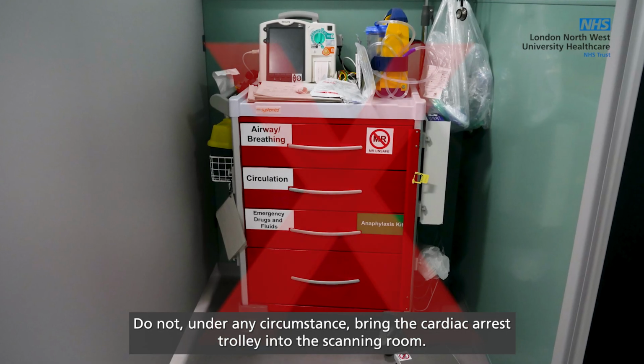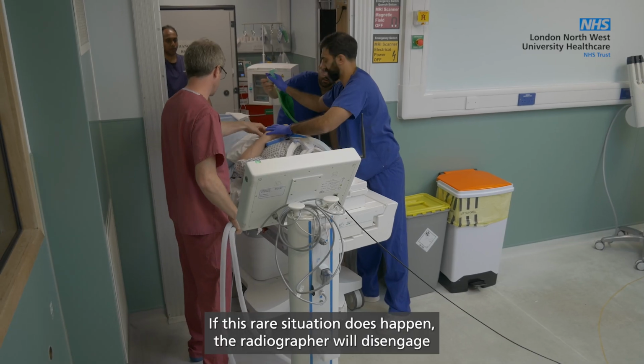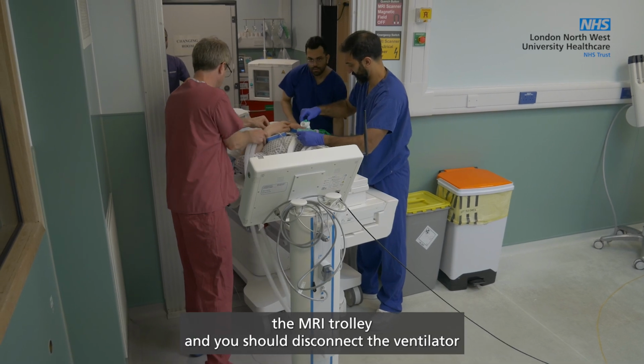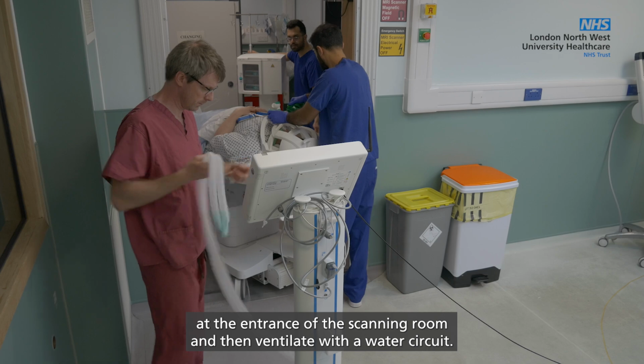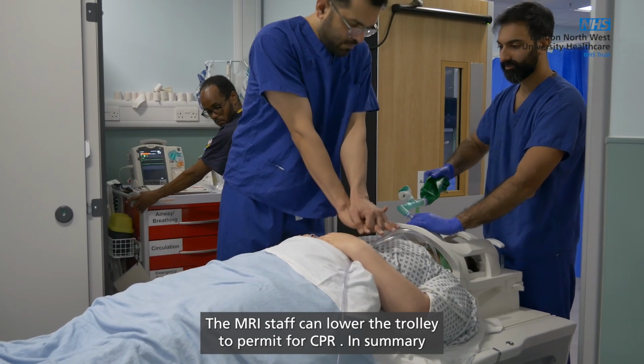Do not, under any circumstance, bring the cardiac arrest trolley into the scanning room. If this rare situation does happen, the radiographer will disengage the MRI trolley, and you should disconnect the ventilator at the entrance of the scanning room and then ventilate with a water circuit. The MRI staff can lower the trolley to permit CPR.